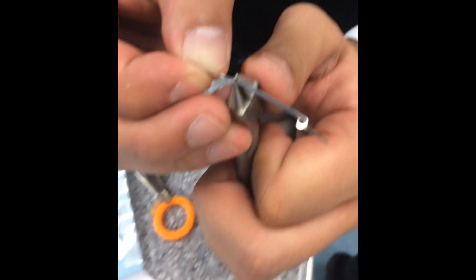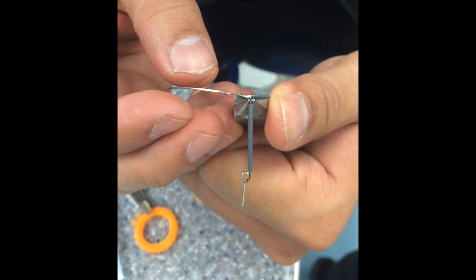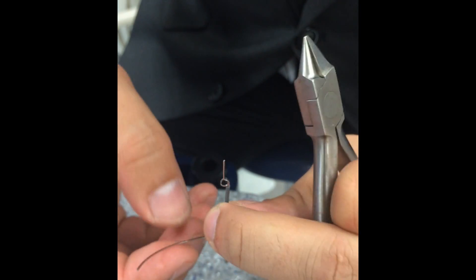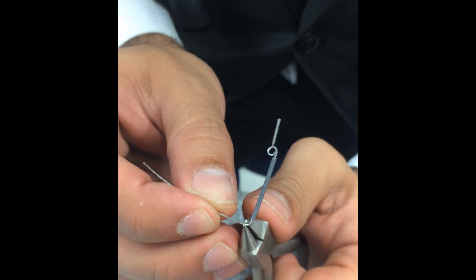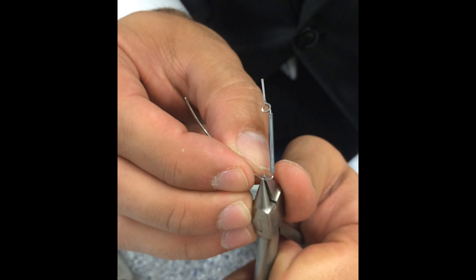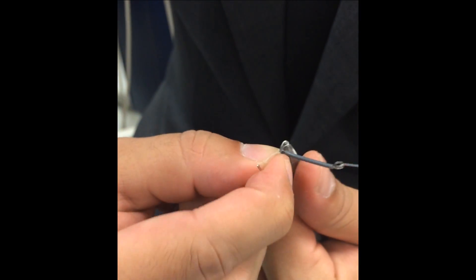Then you move up, like this. Then you go like this — you bring it back. You move a little bit higher. And you do your little hook. It's a little line of summit.